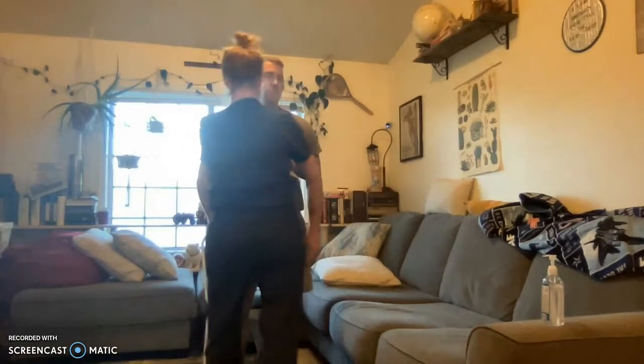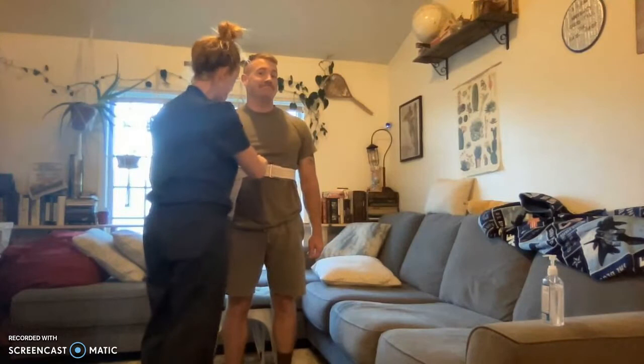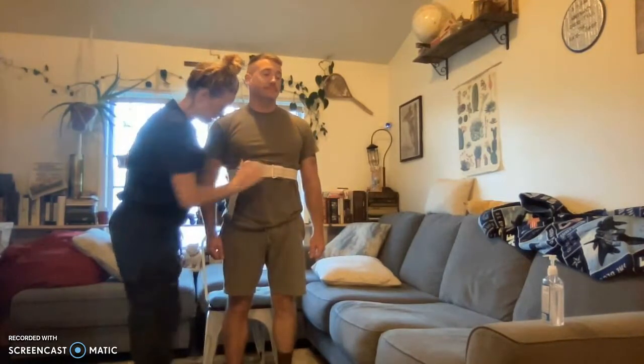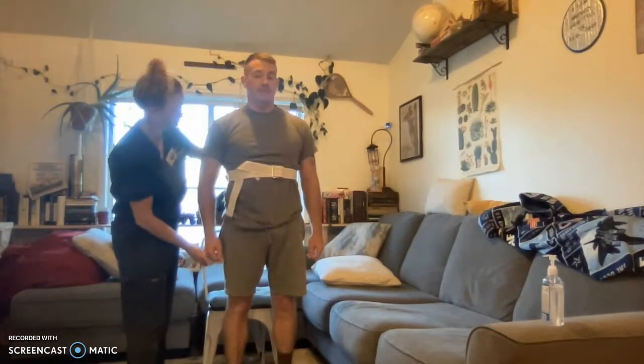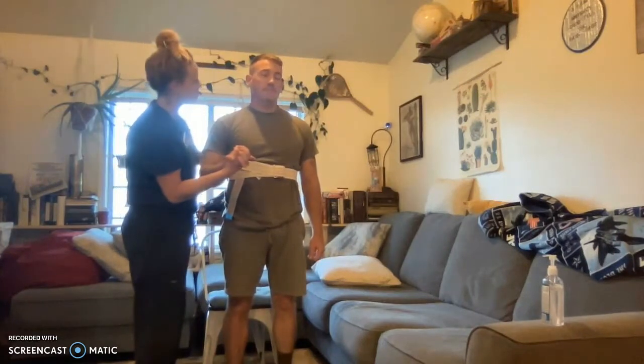Good. Okay, I'm going to come around here on this side. This is your weak side, correct? Yes. Okay. Let me hold your hand. All right. You ready to take some steps? Yep. Okay.